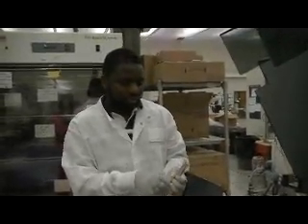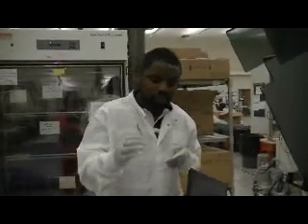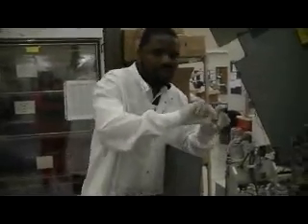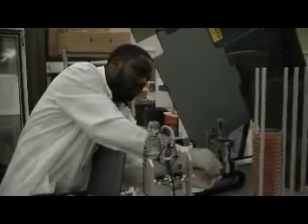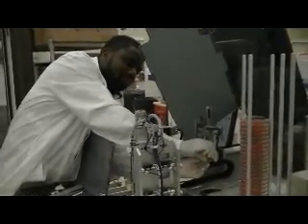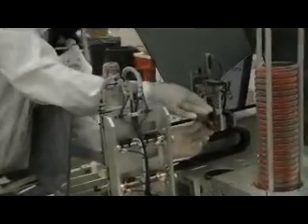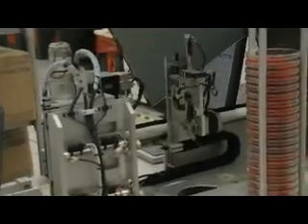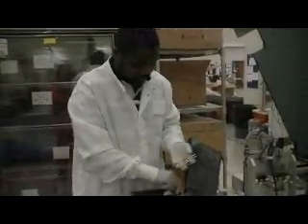Because if it is not calibrated, you end up having a loop that won't be dipping into the urine. It will just be going sideways, and you have a lot of error messages, or you have cultures that are not growing anything on them. So you put back your loop. That's it. And if you want a new loop, you've also got this tool that you can use to make another new loop.